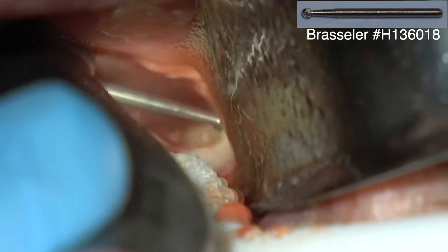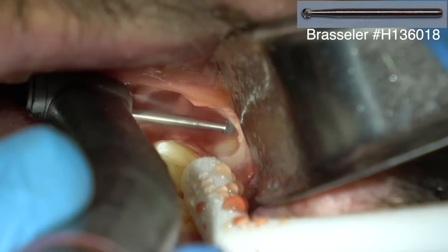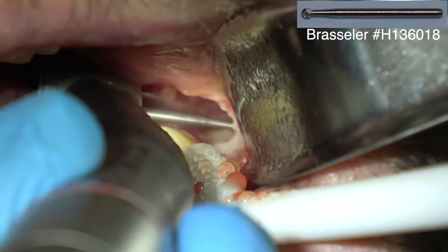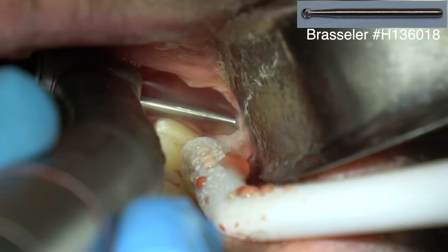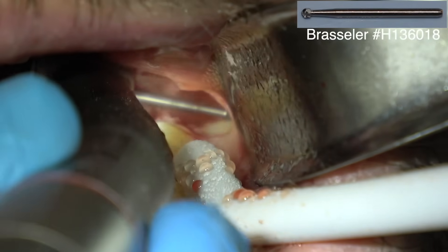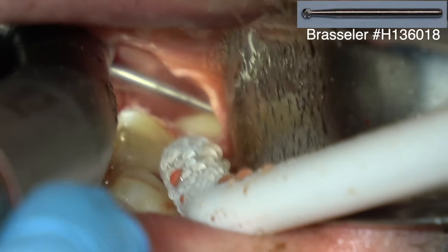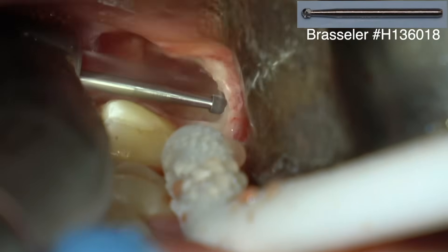This is not a teaching video to teach you how to do this — it's like watching a movie. I don't suggest you try one of these unless you've had considerable surgical hands-on training. A horizontal impaction is twice as easy as a tooth angled like this one, especially if the roots are fully formed.